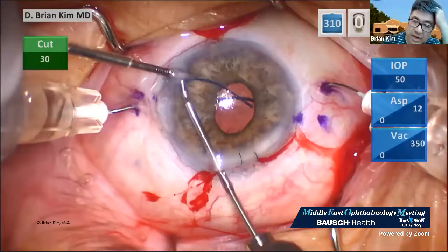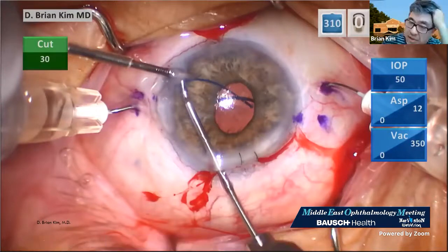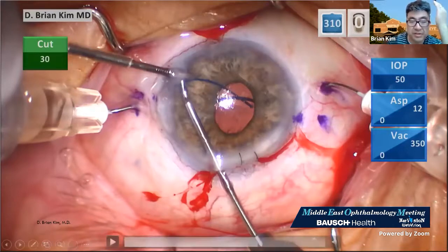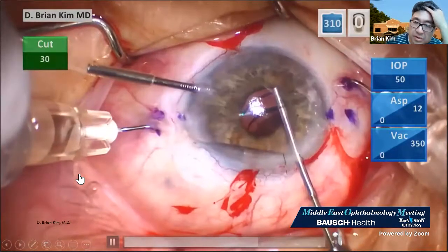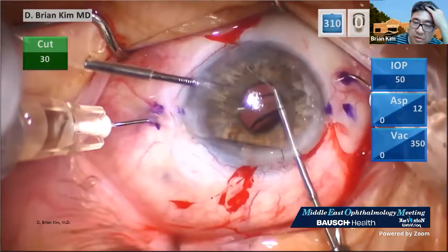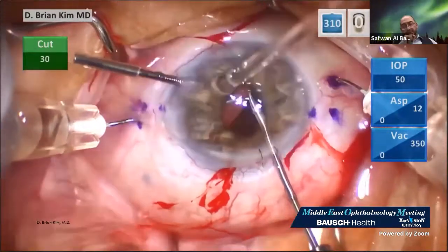Yes. Right. Well, right now, I'm not applying too much tension, and you saw with this Simulize eye, you're right. There are more risk factors, definitely, when you try to use excessive force on those PMMA haptics. I agree. Oh, great. Yes, see the bubble is toward the haptics.